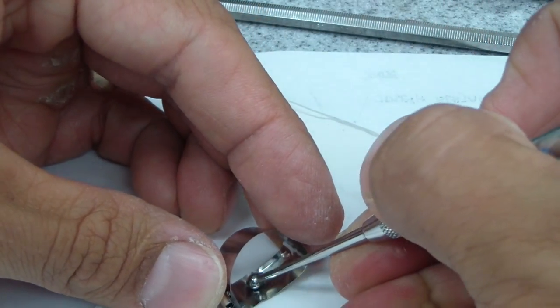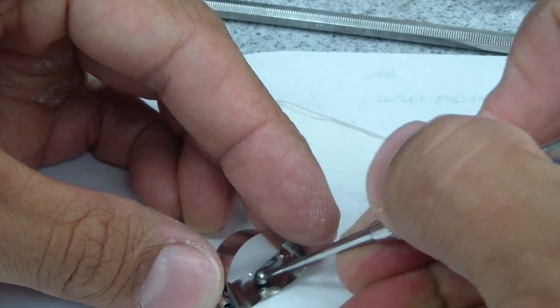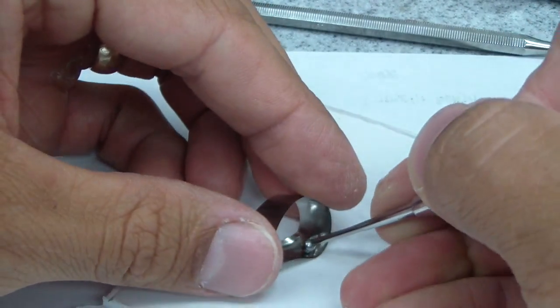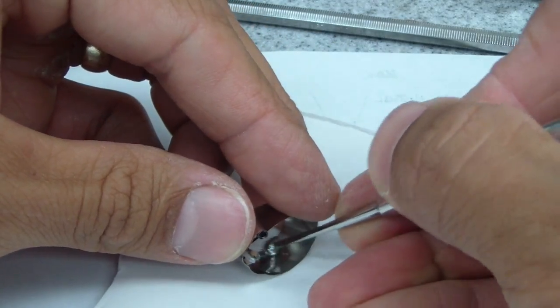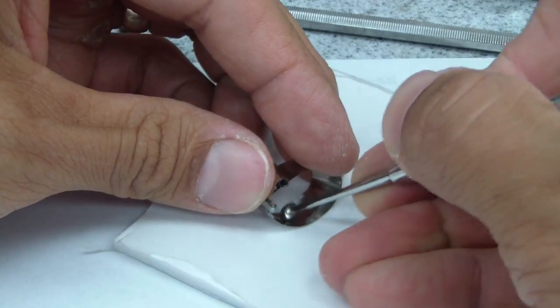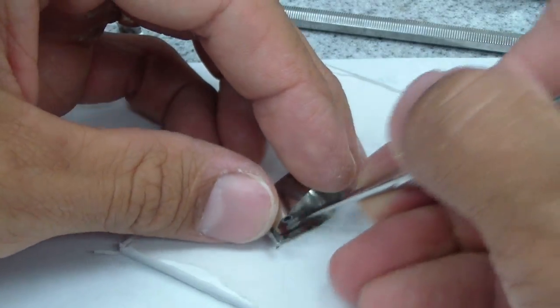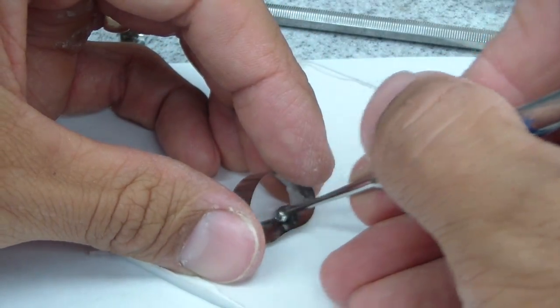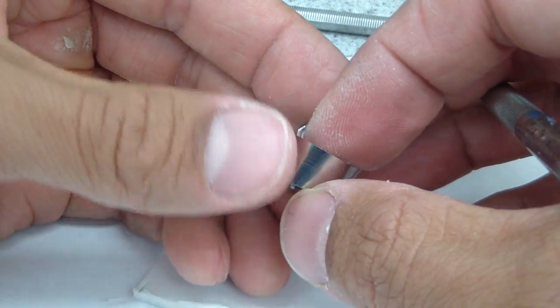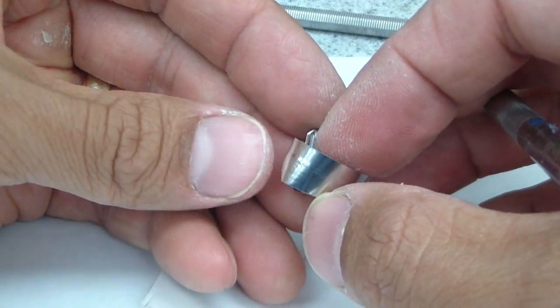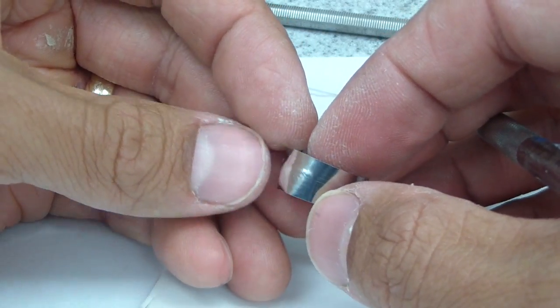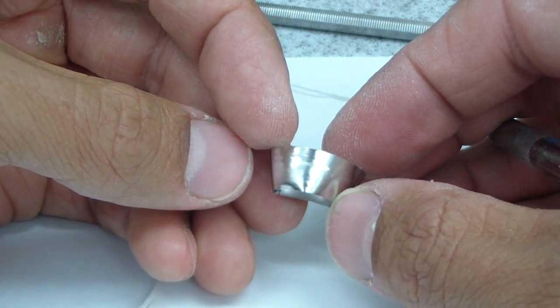Just smooth that out. Okay, so now you can see it's sort of that kidney shape. This reminds me of those Paladent. I mean they come pre-contoured already. The kidney shaped Paladent or Bitime ring sectional matrices.